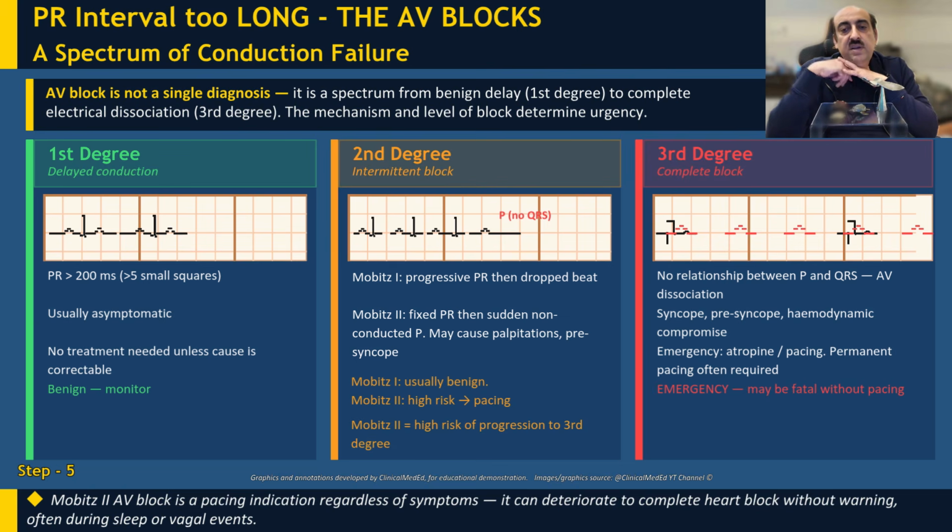On the other hand, third degree heart block, or complete heart block, is where there is complete dyssynchrony between atrial activity and ventricular electrical activity. So you will have a separate PP interval and a separate RR interval, and there is no correlation between the P and QRS. Also, one other important aspect is that the QRS will be wide, because it's not normal sinoatrial nodal conduction. An ectopic focus below the AV node will take over, and that leads to slower conduction, which leads to a prolonged QRS. So that's an important part to consider.